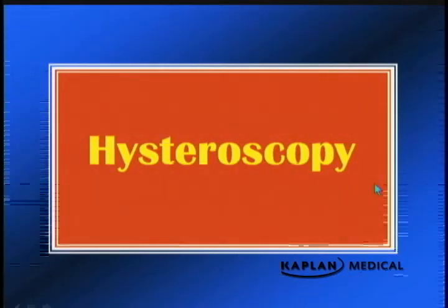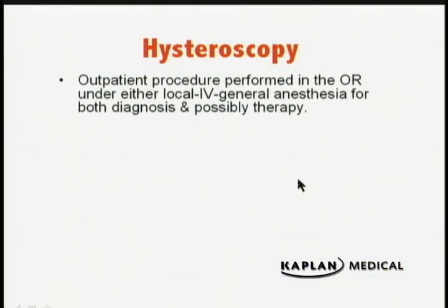Hysteroscopy is looking inside the uterus. Oscopy, looking in; hyster, uterus. This is an outpatient procedure performed in the operating room typically under either local, intravenous, or general anesthesia. You can use it for both diagnosis and therapy.